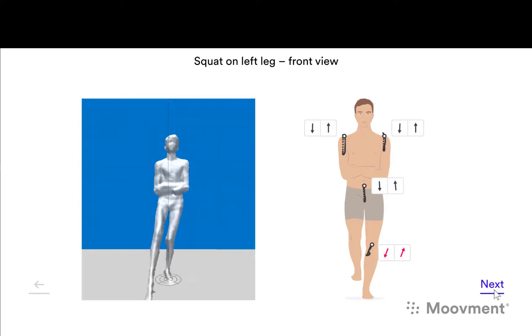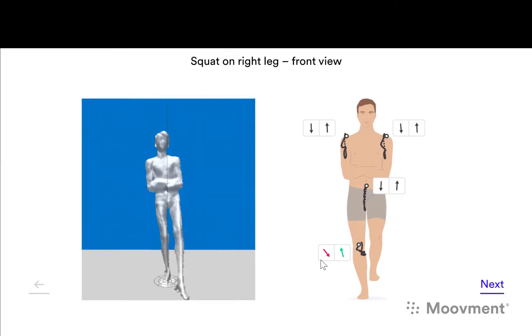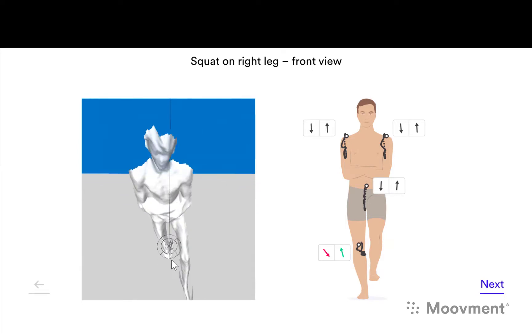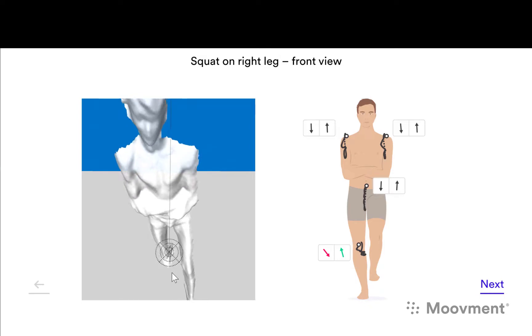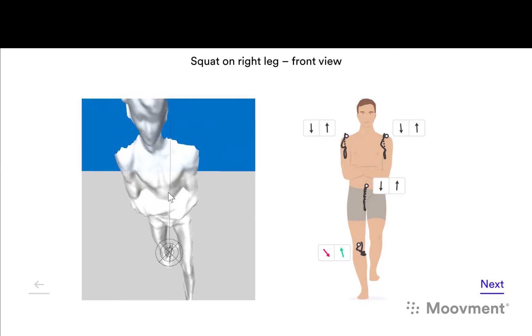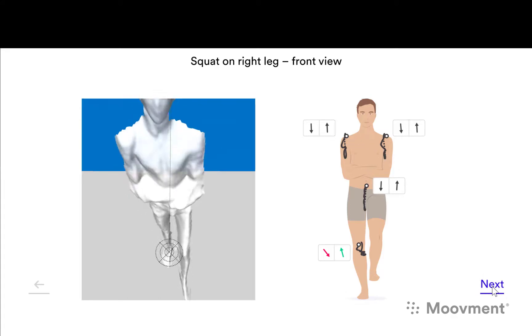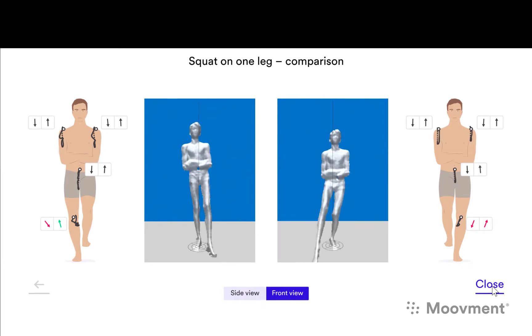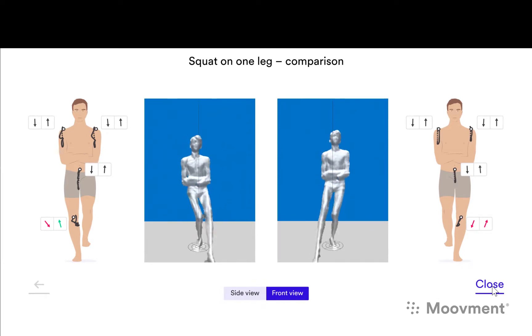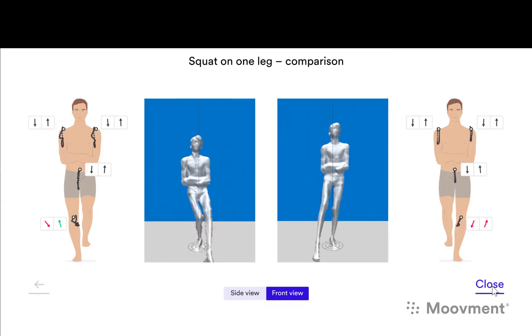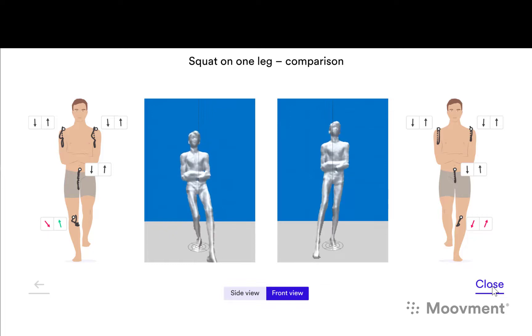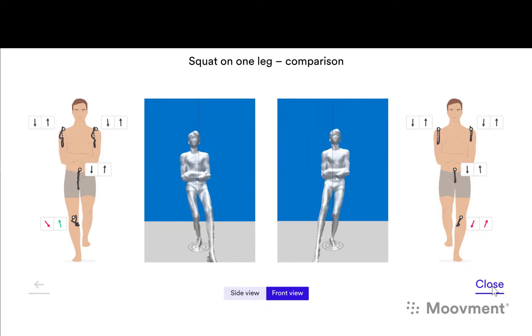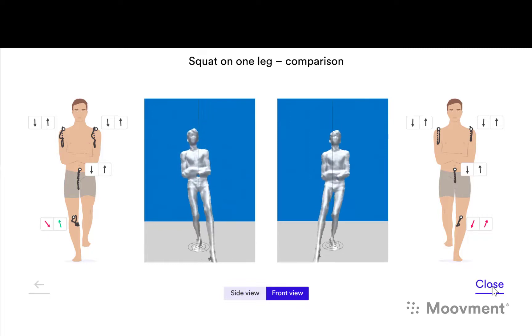On the right hand side it also goes in quite dramatically but it's much messier—you can see the amount of internal rotation that's occurring here. It's very evident that he's got internal rotation control issues with a little bit of trunk rotation on the way down, and that's what's making his shoulders look quite messy. So if we compare those two, the control elements are different but the angles are not significantly different. Both knees are going towards the line of gravity over the ankle, but there's a significant difference in compensation in the upper body. The left shoulder is up on both left and right squat.